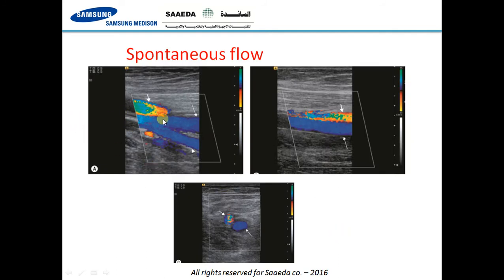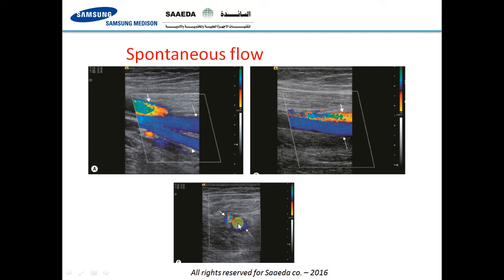In this case, you can see the artery and the vein. There is spontaneous flow in the vein and the color is completely filling the lumen — this is a normal vein with no evidence of venous thrombosis. In axial views, you can see the artery and vein with color homogeneously filling the whole lumen of the vein.